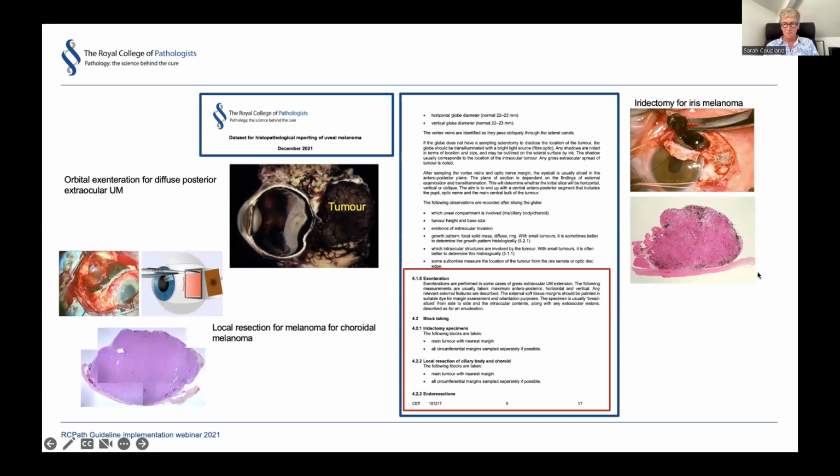So when we receive such samples, it is important to report the surgical margins, orientate them, whether it's anterior or posterior, and obviously also report whether any tumor cells are passing into the intrascleral surgical margin. More often than not, the surgeons do place a ruthenium plaque over the surgical site. However, we are required to report the extent of the tumor cell spread.